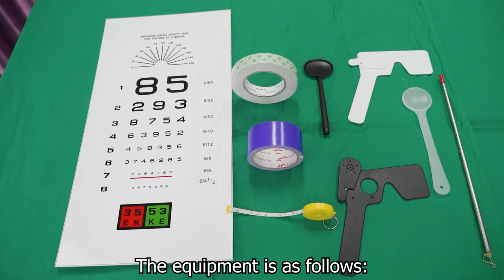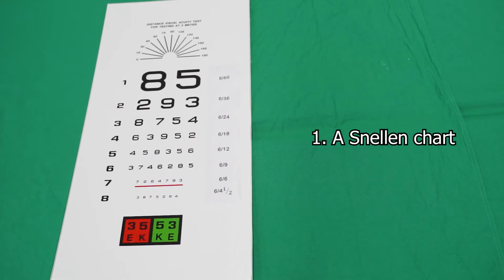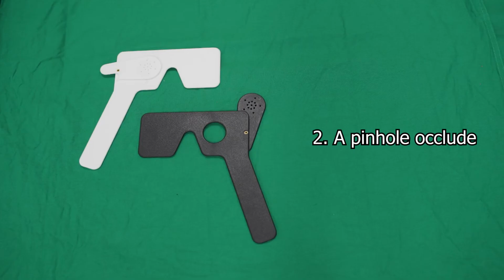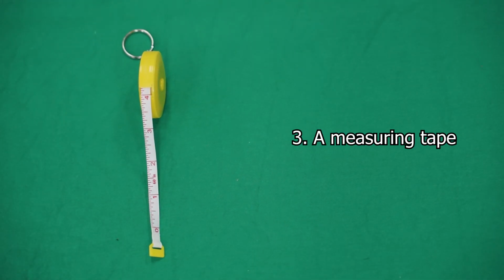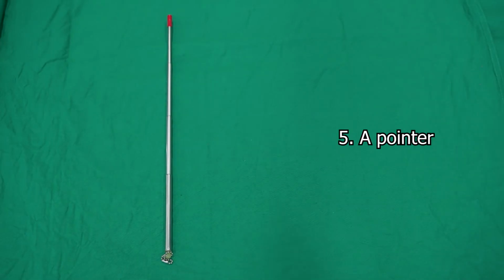The equipment is as follows. 1. A Snellen chart. 2. A pinhole occluder. 3. A measuring tape. 4. A masking tape. 5. A pointer.